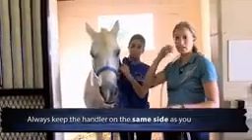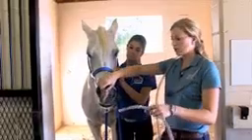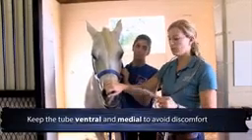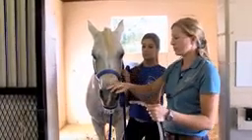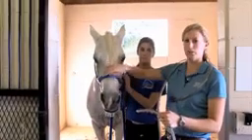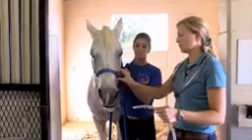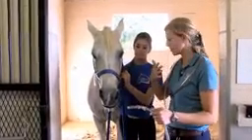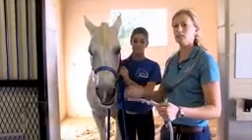So I have my handler again on the same side. Come up here, just nice and slow. I'll grab her nostril. Just kind of rub the inside of her nose here, just letting her know I'm here. So then I'm going to start passing the tube, and it's important to keep in mind that you want the tube to be ventral and medial, so down and to the inside here, so you can avoid the ethmoids up here, which if you do hit those, they often will get a nosebleed. And when you're passing the tube, you can see that my handler is kind of pulling her nose down here and flexing her head, and that gives you a better shot of going in the esophagus, rather than if their neck's extended, you'll go right into their trachea.